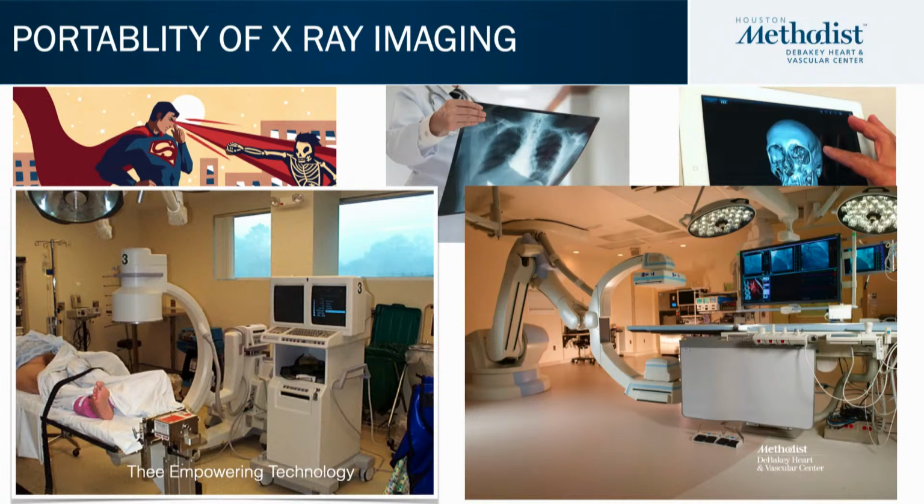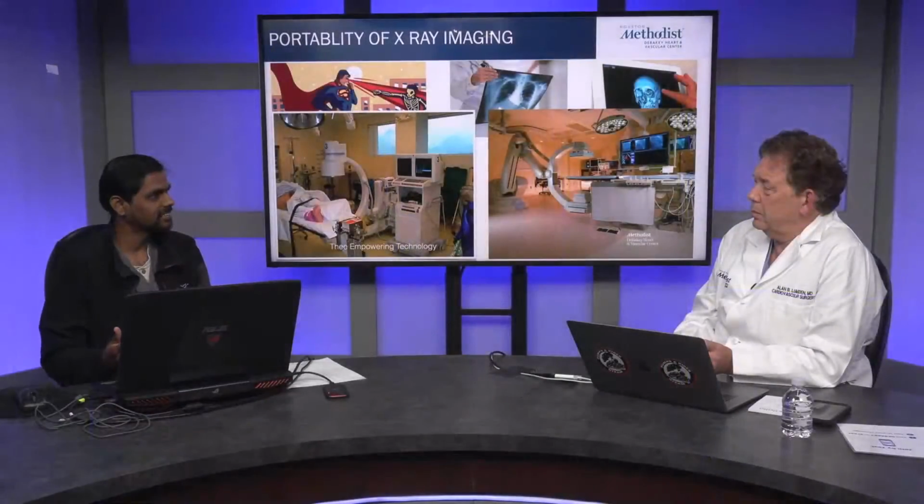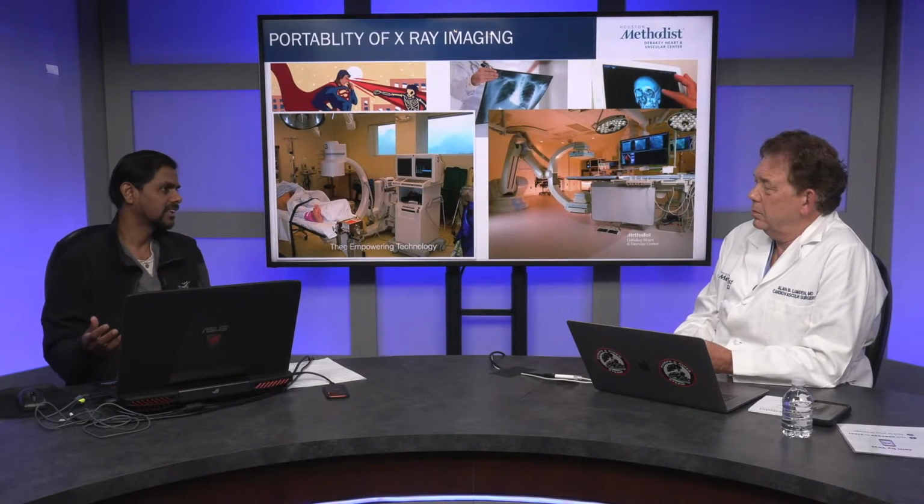But amongst the surgical specialties, the key differentiating factor is knowing what we did to our patients intraoperatively, or what we do to our patients intraoperatively. Vascular surgery is definitely one of the surgical fields that early on really endorsed intraoperative 2D/3D imaging. But as an imaging scientist in the field, I see so much opportunity. We still live in the realm of opening somebody's chest or abdomen and closing it, and then finding new findings at the end of the procedure that could have been caught if imaging was available.